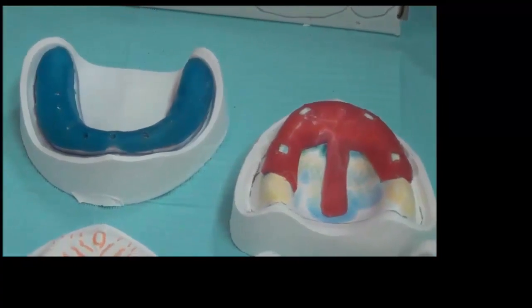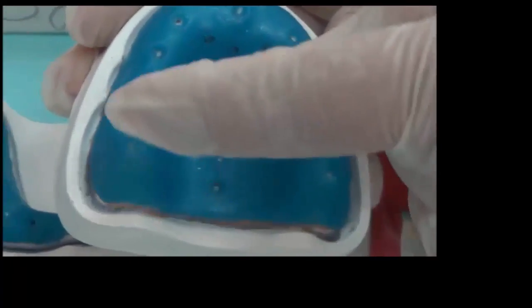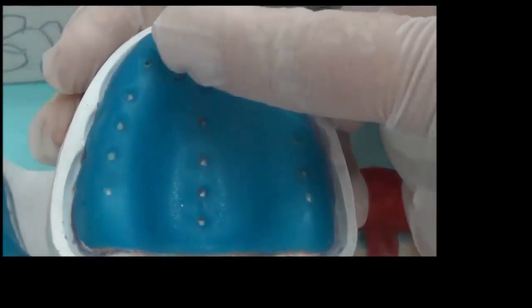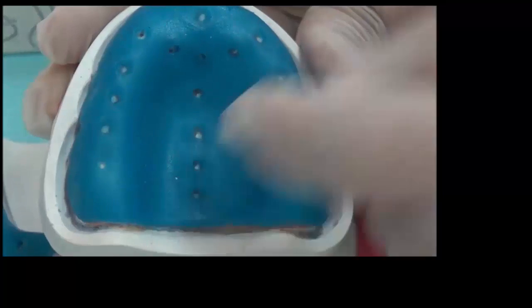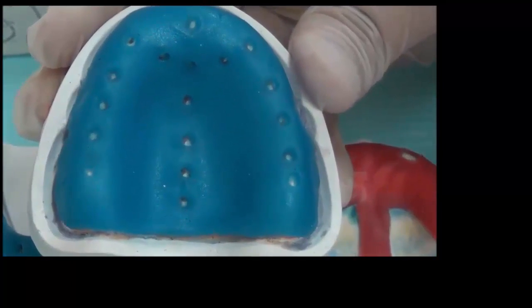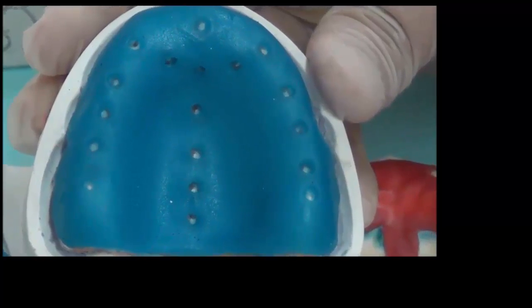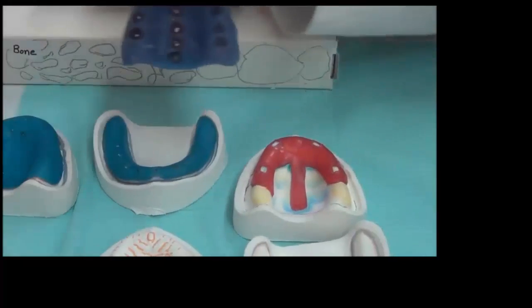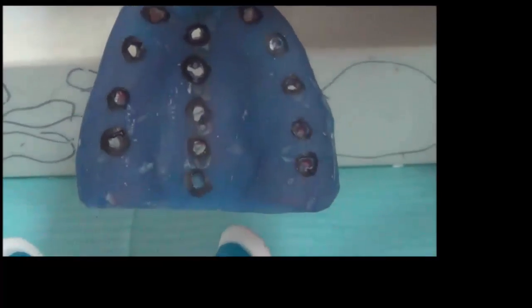If on the upper we place the holes in the following areas, once more on the areas we need to relieve, which are in front of the tuberosities, over the crest of the ridge, over the incisor papilla, the rugae area, and the mid-palatine suture area, just before placing the handle. Once we place the handle, we will have the following situation with holes inside, and impression material is free to escape from these relief areas.